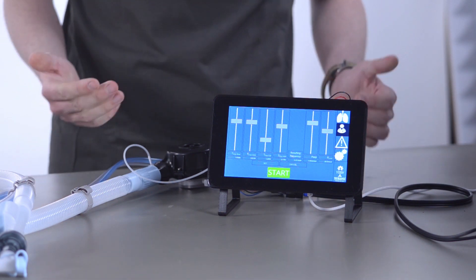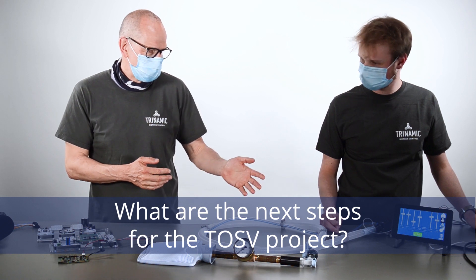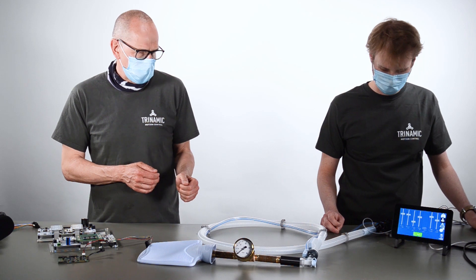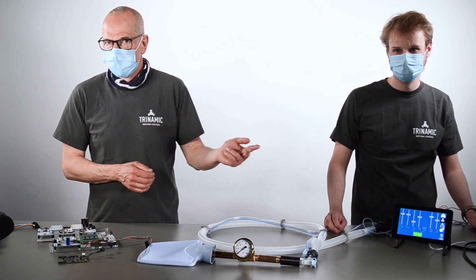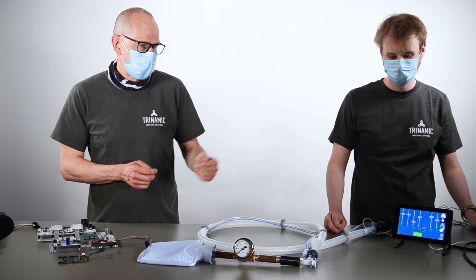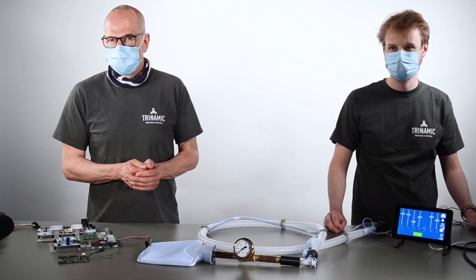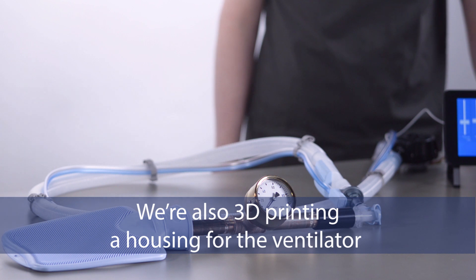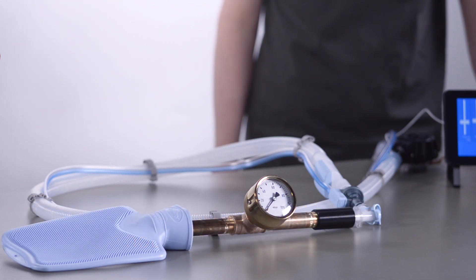The next steps on our roadmap to improve this are: integration of different flow sensors that we will try out, adding safety features, and adding an uninterruptible power supply. These are the next steps to drive this to the next level. Parameters for different popular motors and blowers will also be made available.